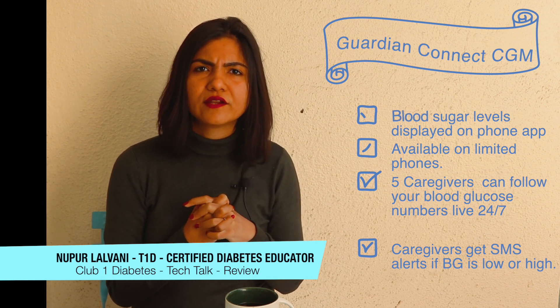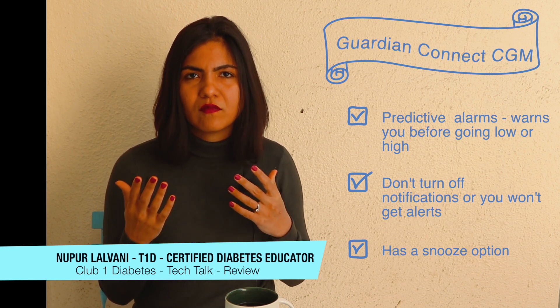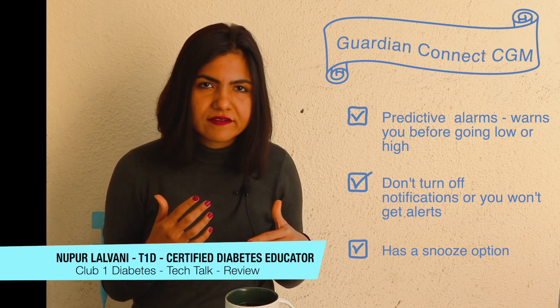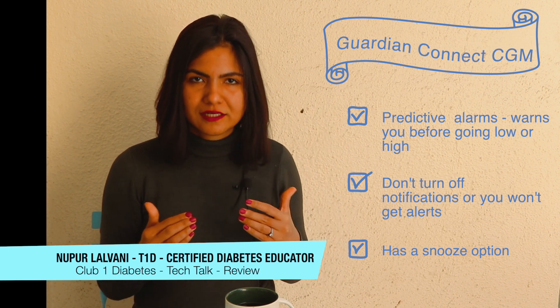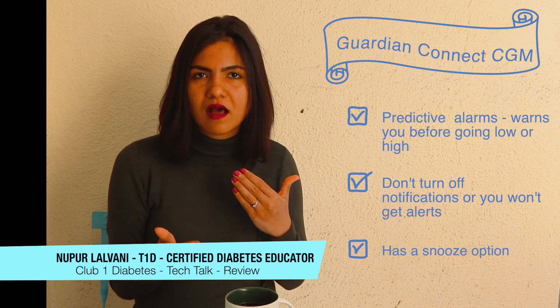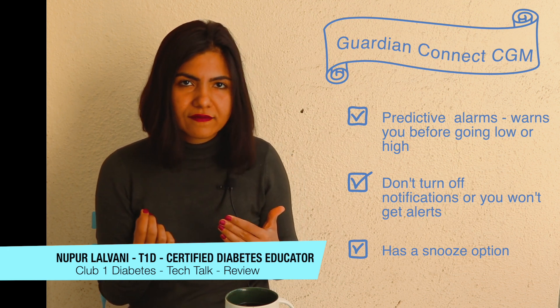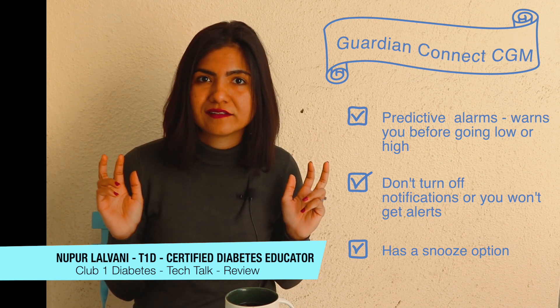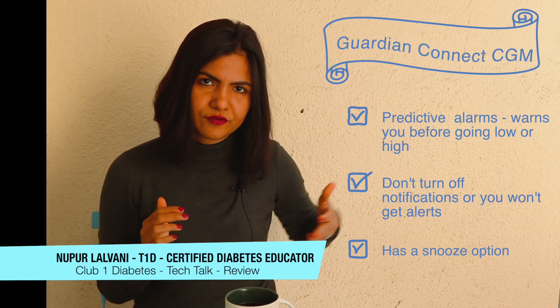Apart from this, something very interesting it has is predictive alarms. In any CGM or FGM, you set a range — say your lower range is 70 and your higher range is 130 or 150. So before you touch that range, if you're fast approaching a low or a high, the Guardian Connect will alarm you. It'll notify you on the app and also notify your caregivers. I'd call this being proactive about your diabetes care, because you can take quick actions based on the data you receive on your phone.